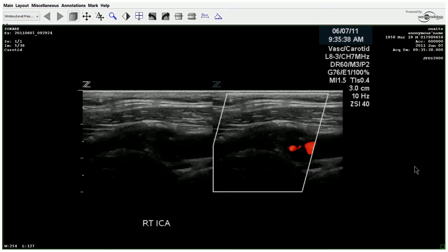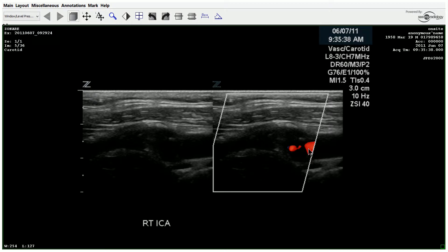Moving distally, they come to the ICA and you can see the color just stops. Now you should be thinking — this is likely a total occlusion, possibly, but we're going to investigate further.